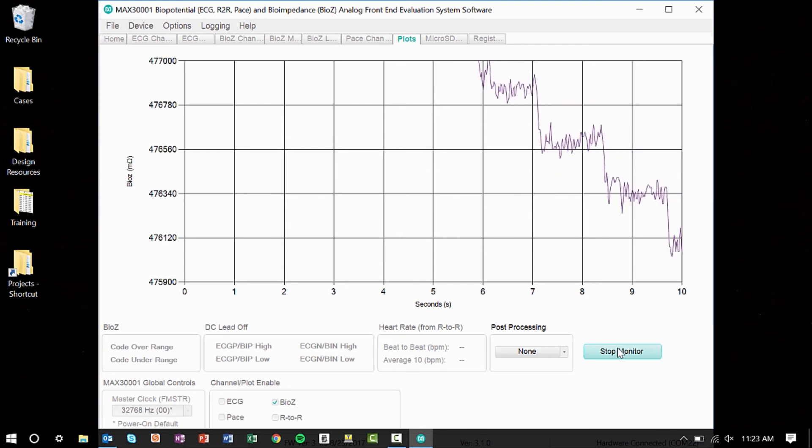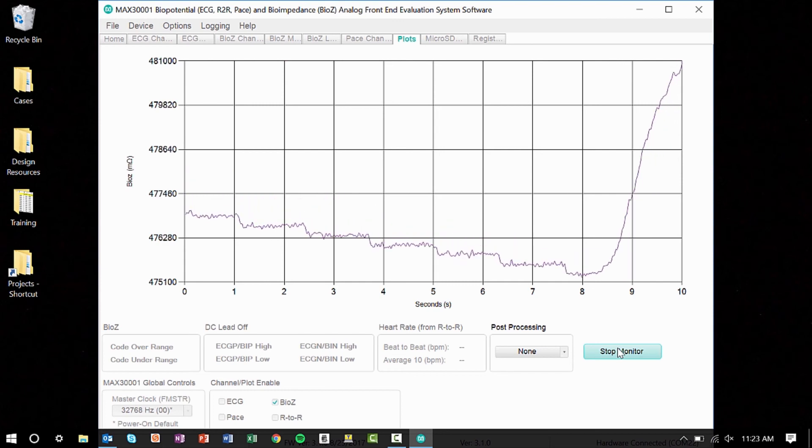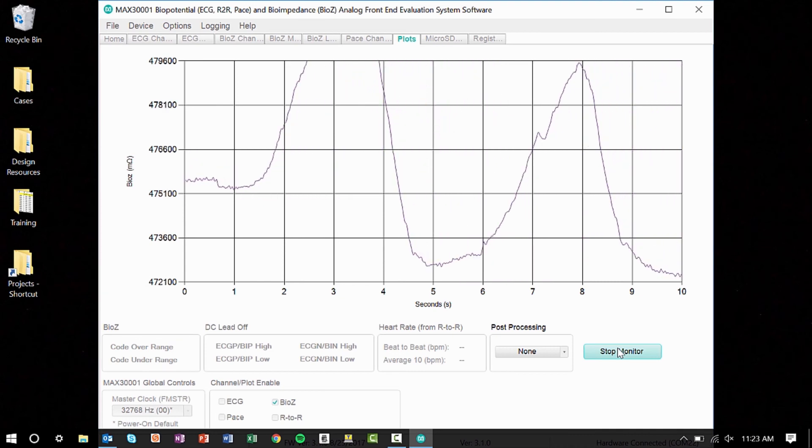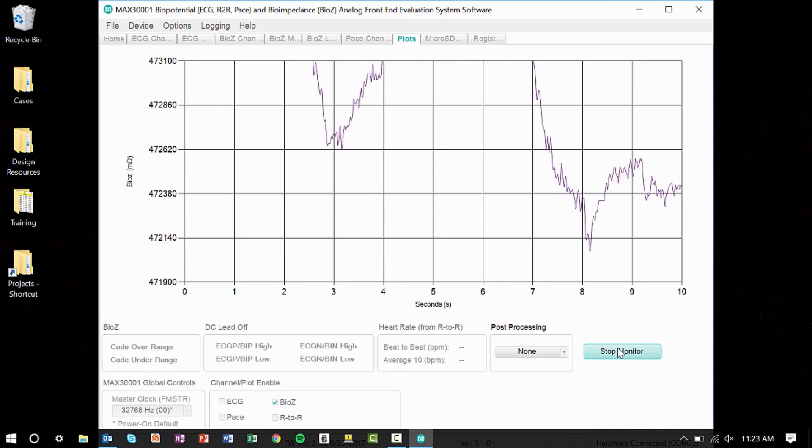If I take some deep breaths, you can see a larger change in impedance due to the filling of my thoracic cavity with air. Now remember, this is just a starting point to get your BioZ measurements, and from here you can modify settings to match your application.